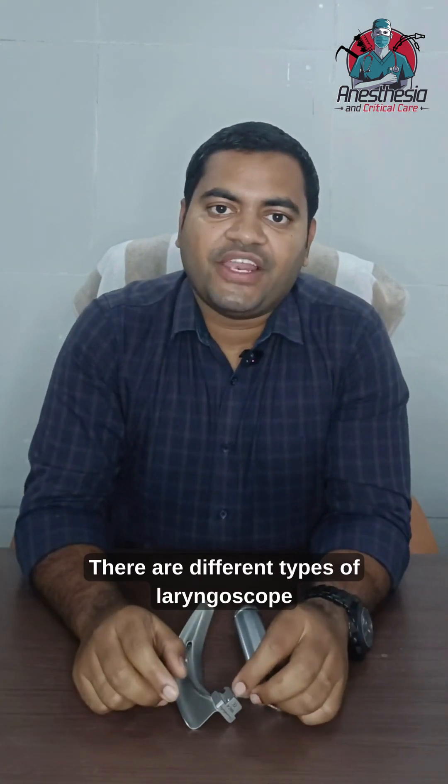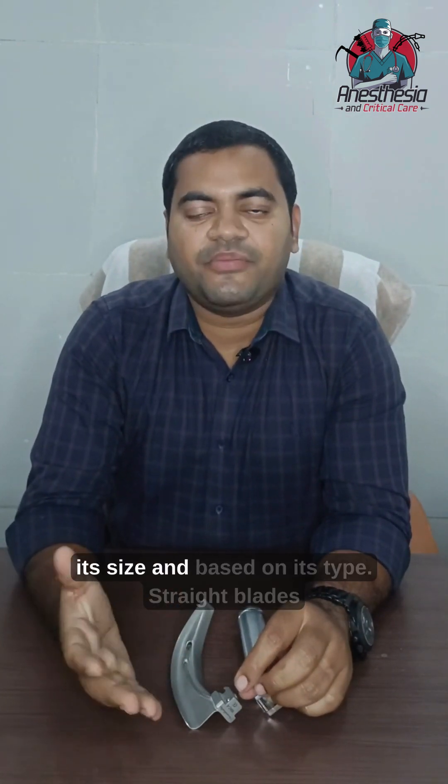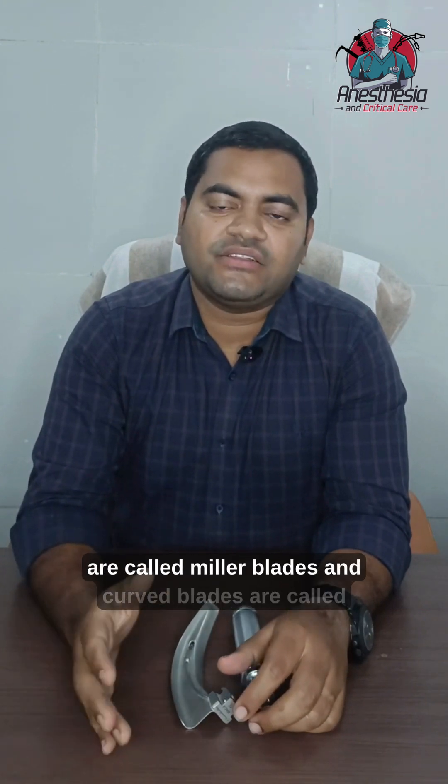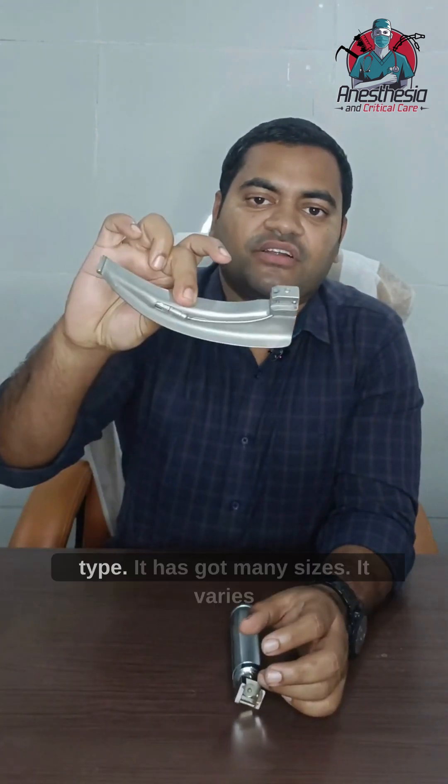There are different types of laryngoscope blades based on size and type. Straight blades are called Miller blades and curved blades are called Macintosh blades. This is a Macintosh blade, which is the curved type.